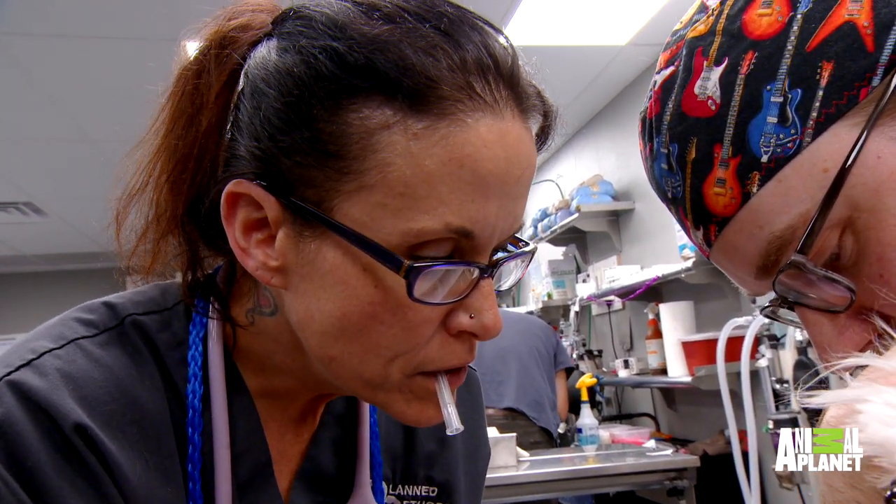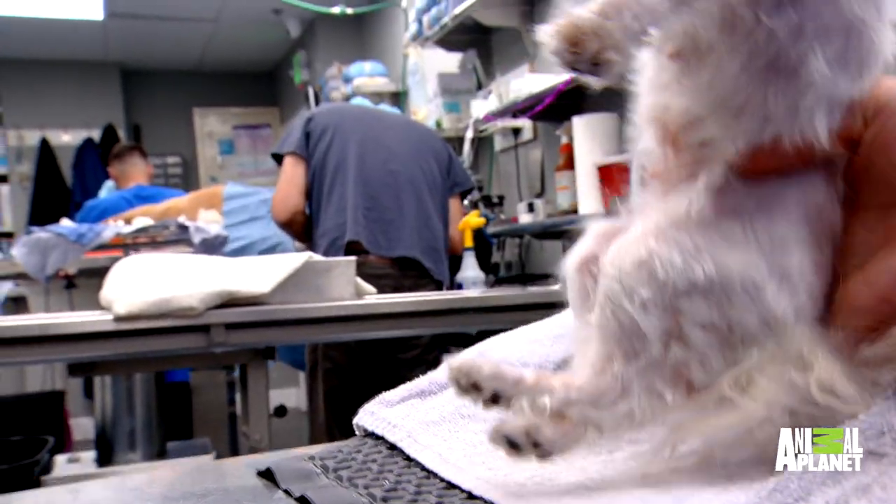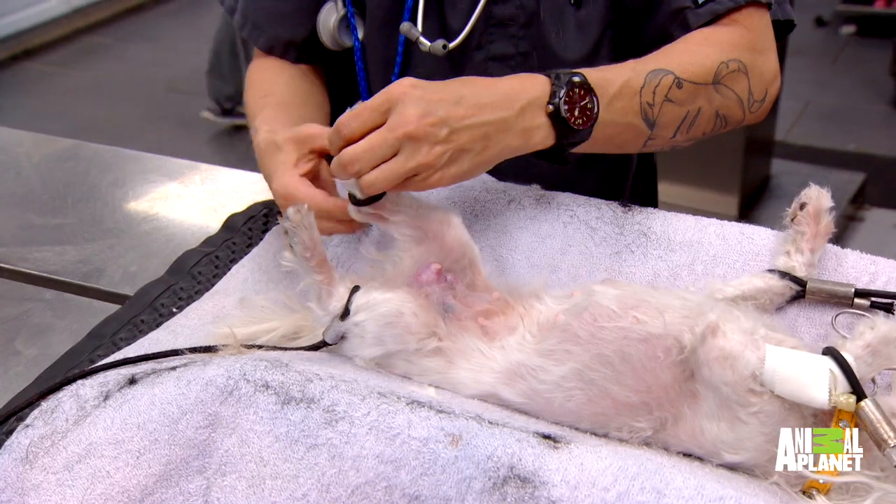Oh, good girl. Yes, it's okay. So with Faith, we're doing a spay and a mammary mass removal. We're going to do the spay first so that we don't have any kind of contaminated cells that might go into the abdomen.